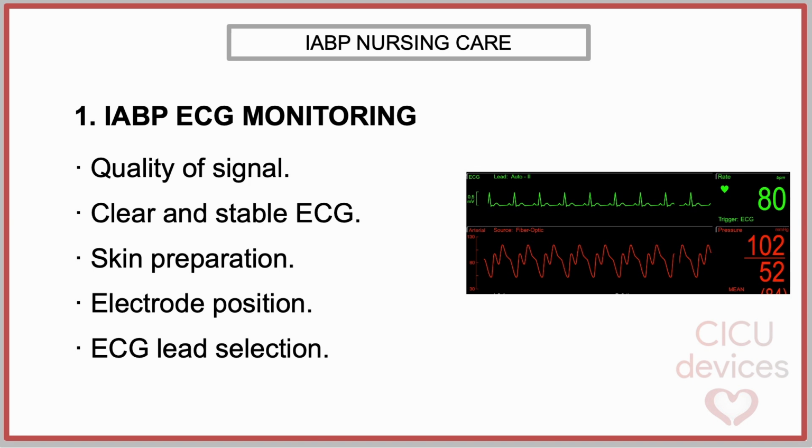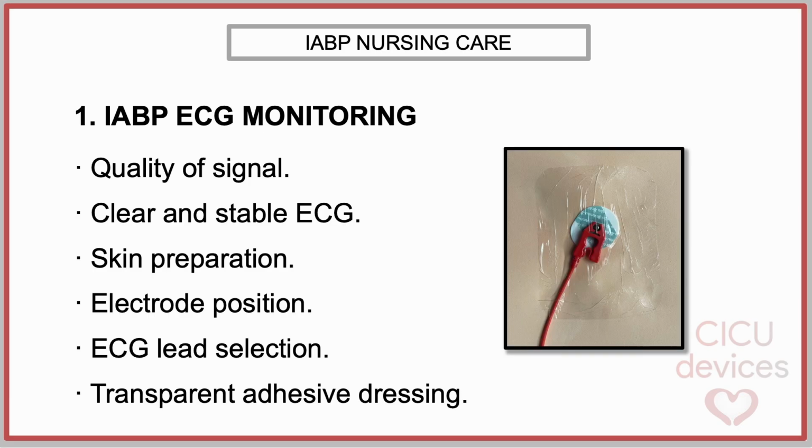If an alternate lead choice is desired, the electrocardiographic lead that provides the clearest and most consistent R wave amplitude should be selected, minimizing noise and avoiding leads with low voltage or excessive baseline instability. Securing the ECG electrodes is also an important aspect of care.